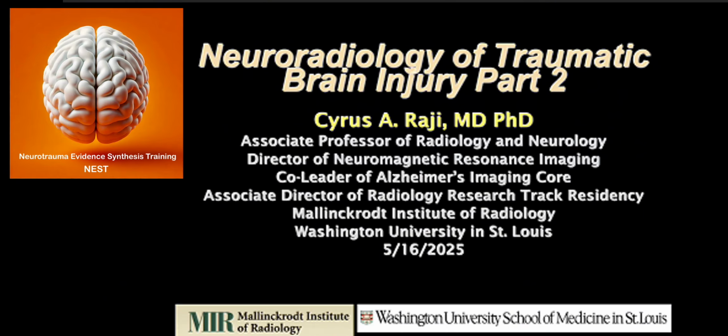Most of the normal databases are done in adults. Within that bin, some normative databases are across the adult lifespan, but some are more for older age groups. I don't know of a tool that necessarily focuses on pediatric TBI specifically at this point. However, I do think if they could develop such techniques, it would be quite valuable to have.